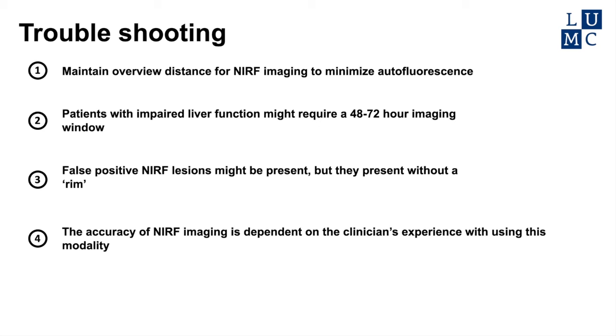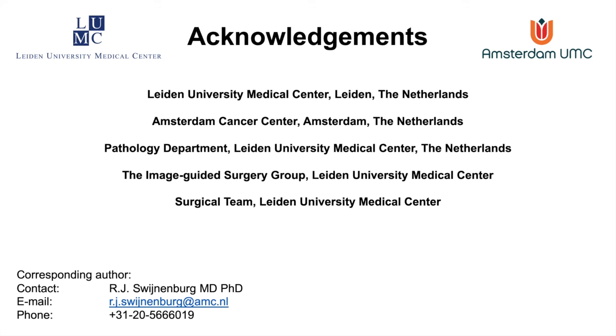Last and most importantly, the accuracy of near-infrared imaging, regardless of the contrast agent or camera system, is dependent on the clinician's experience using fluorescent imaging. Although the efficacy of this technique needs to be further studied in a larger cohort, our data showed promising results. A prospective trial studying the effect of this technique on the surgical tumor margin is already including patients.